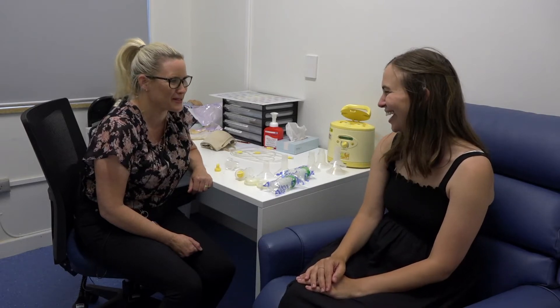Hello, my name is Joanne. I'm one of the midwives and lactation consultants working at the breastfeeding centre, and I'm here today with the lovely Sarah to demonstrate how to use an electric breast pump. Hi Sarah, thanks for coming in and helping us.